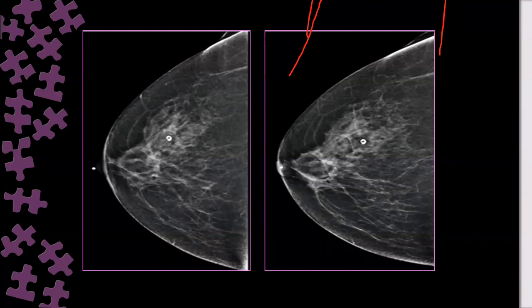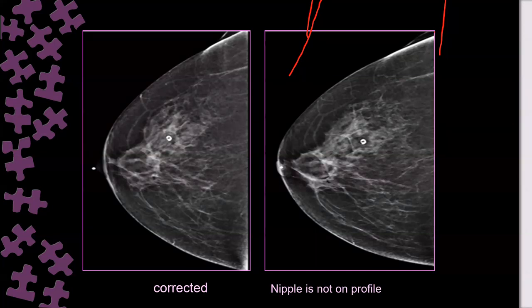This is the nipple; I think there is malpositioning of the nipple, inadequate profiling of the breast. Any malposition affects the compression and contrast. But generally, just the nipple will get corrected. The other effect is not much. It's only the nipple.